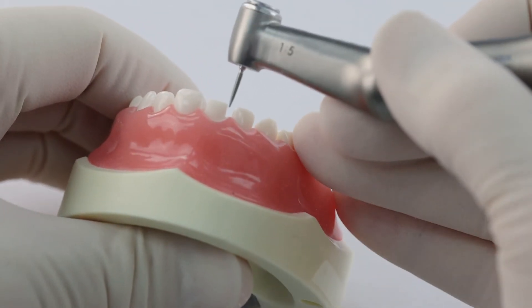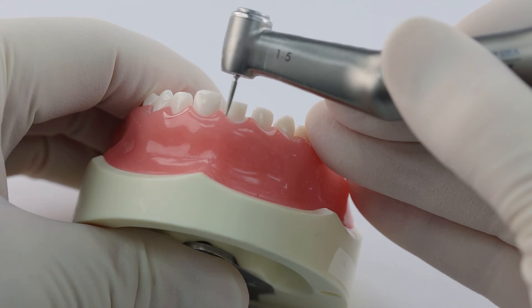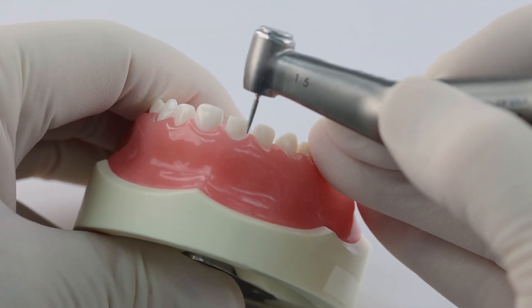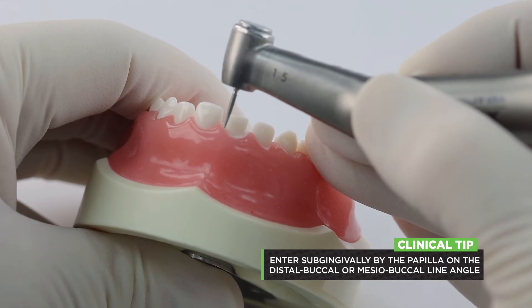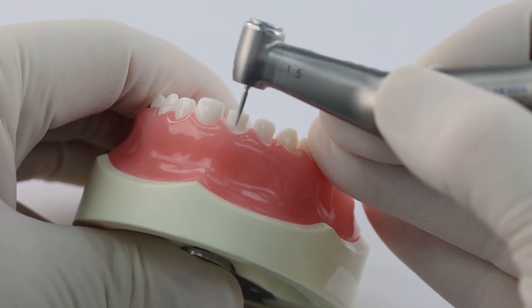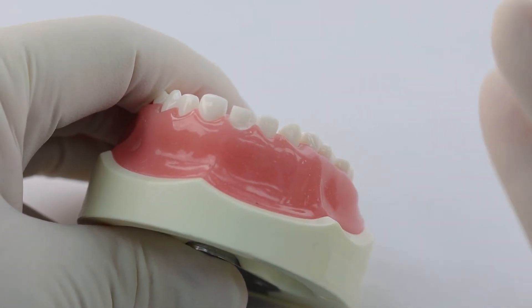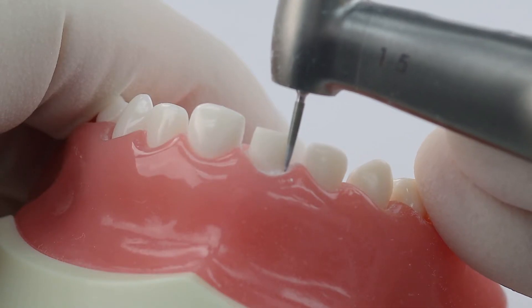Now we're going to do our subgingival reduction. For subgingival reduction, remember you're creating a cylinder, so you really want to keep your handpiece parallel to the long axis of the tooth — straight up and down. You don't really want to be tapering it. I'll come in and make a small little hole either at the disto-buccal or mesio-buccal line angle, right next to the papilla, because that's where the tissue is the firmest. If you try to enter right on the straight buccal — especially with mouth breathers — that tissue is so thin it'll tear and bleed. The best way to achieve hemostasis is not to create bleeding in the first place, and that's done with careful preparation.